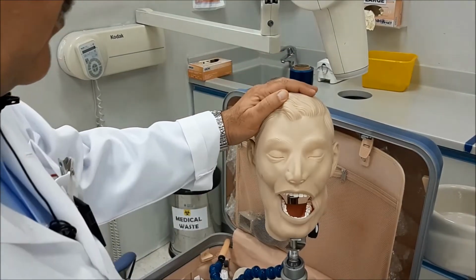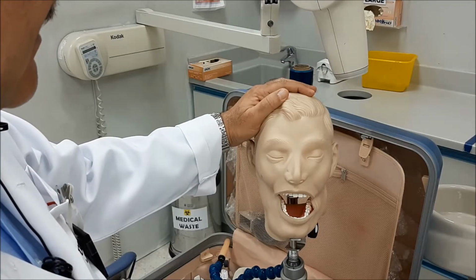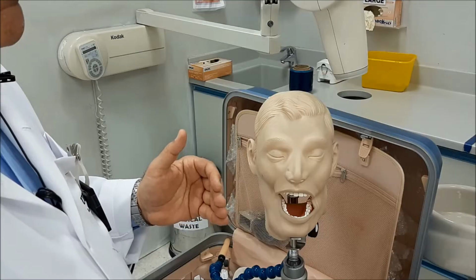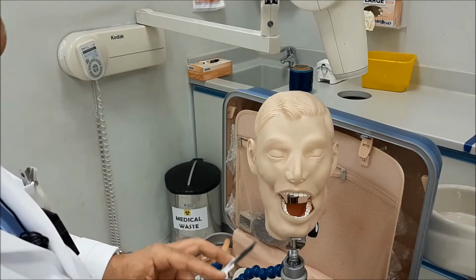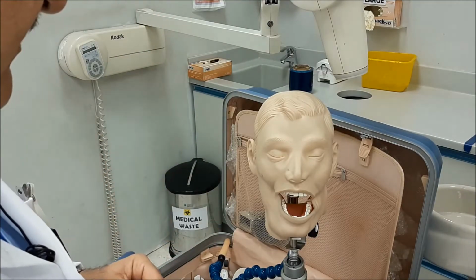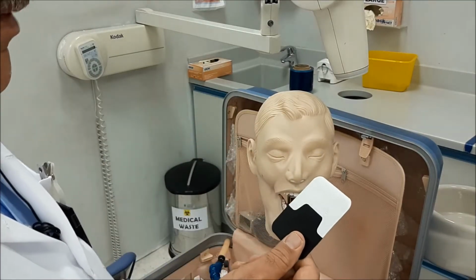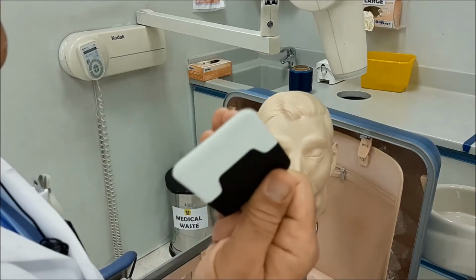Occlusal films can also be done for the mandible, as in the maxilla, and the idea, as we pointed out earlier, is that we need to use these films if we need to cover larger areas that cannot be otherwise covered by the smaller size film. If you're using the analog occlusal film, which is known as the size 4 film, 5 by 7 centimeters, this is the perfect one for exposing the whole mandible.